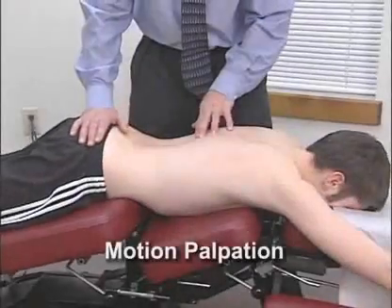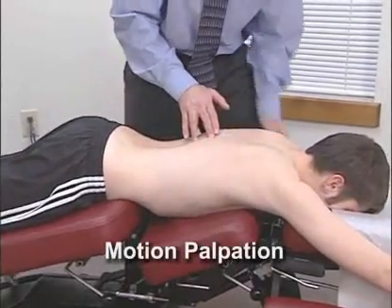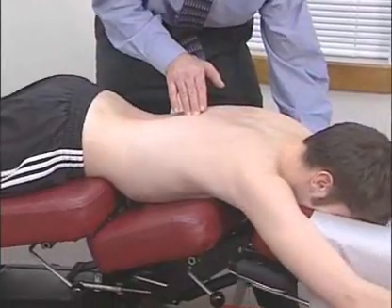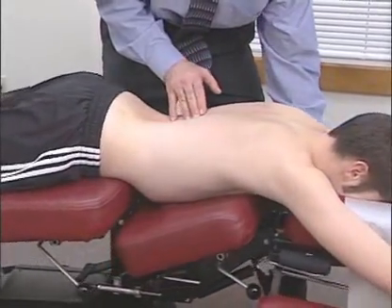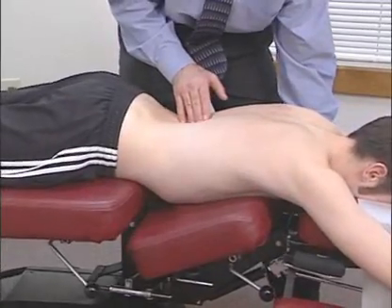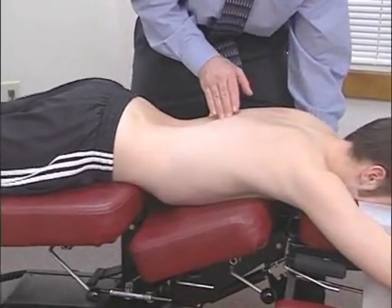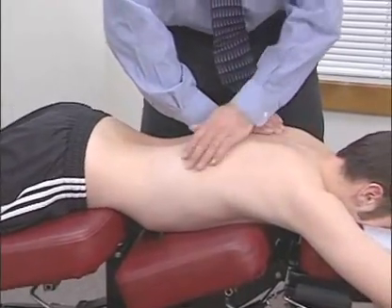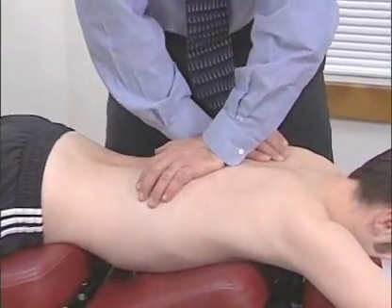With the spine in motion, the practitioner's hands are free to motion palpate spinal joint movement or non-movement, from the base of the skull to the sacrum. The practitioner can palpate long axis motion with one hand or both hands, and observe motion in the articular joints with lateral flexion. Changes in joint motion can easily be noted after spinal adjustments.